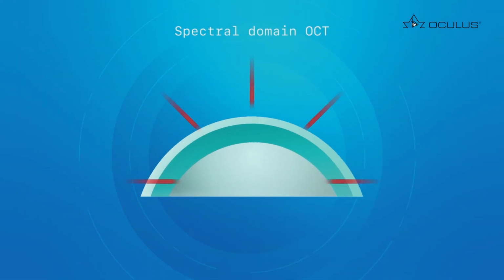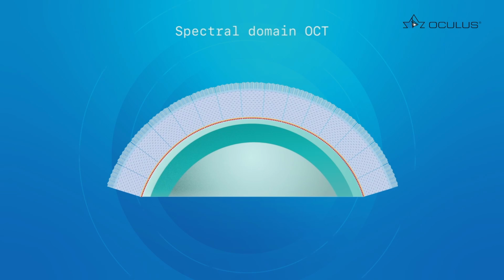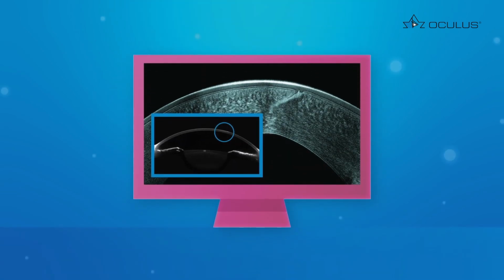Okay, I would say that the scanning mode with the OCT is performed always perpendicular to the surface, so that may enable a consistent analysis regardless of the location of the cross-sectional OCT acquisition. So having this in mind, you can probably think that this will provide you with better consistency from the center to the periphery. There won't be any change in the calculation of the thickness, and this probably will also reduce the distortion of the images, eventually providing you a better image.